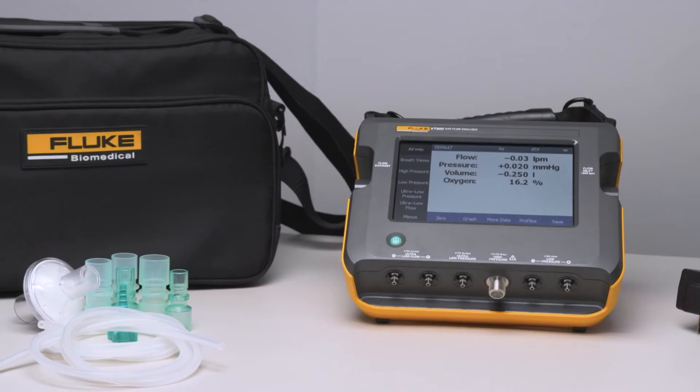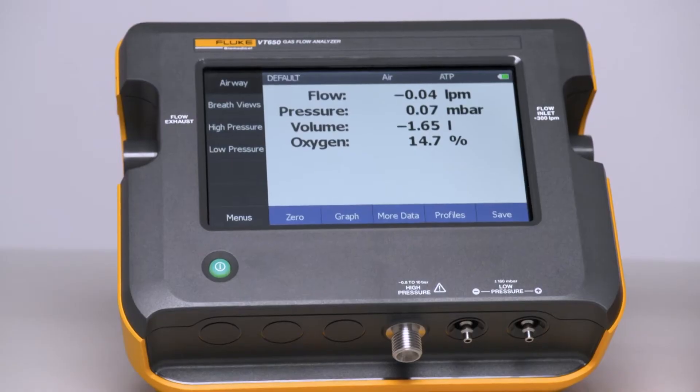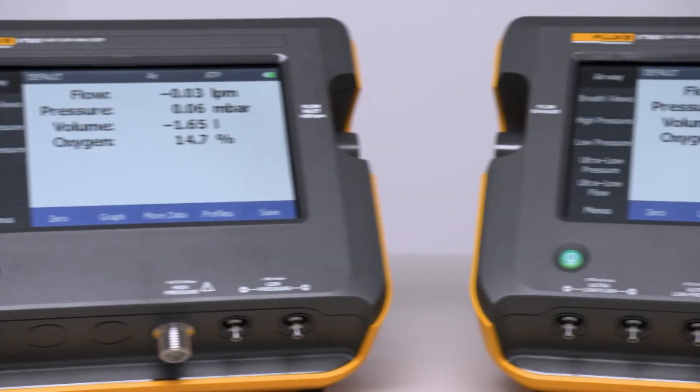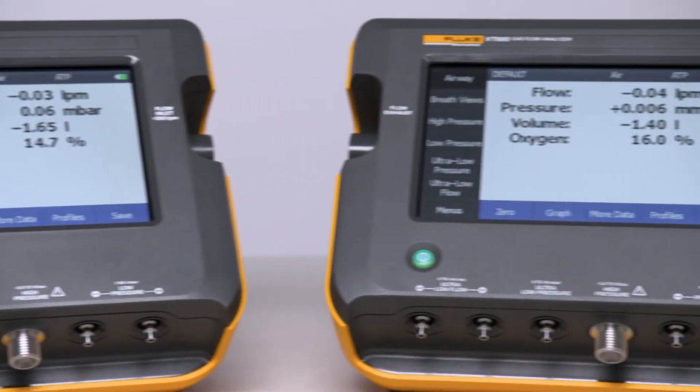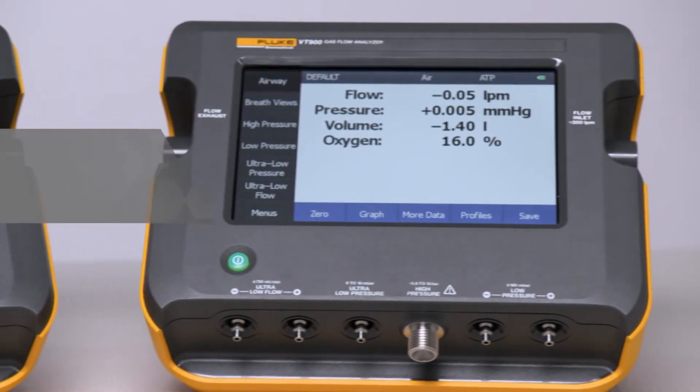Compact and portable, the VT650 and VT900 are perfect for both benchtop testing as well as on-the-go testing in the field.